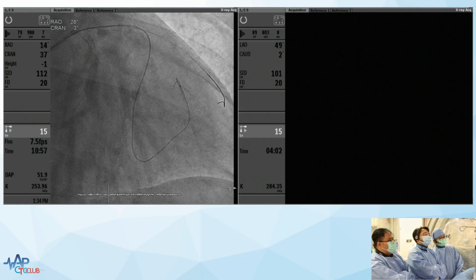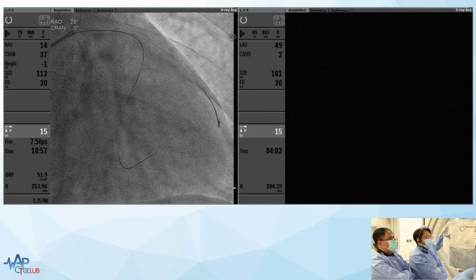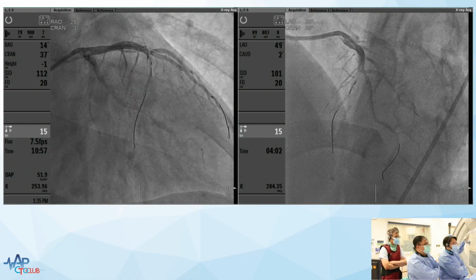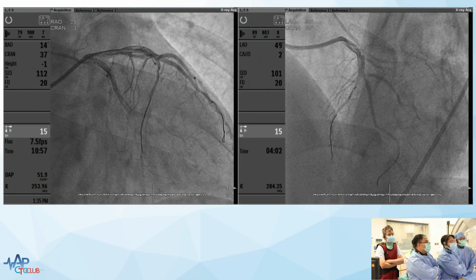Okay. So I guess you've made a lot of progress, and I think this is a really important time to discuss the pros and cons of the approach. Because Sarah, you were saying? Yeah, I'd probably like to try and make a bit more progress antegradely at this point, just because the antegrade cap is still ambiguous for me, and I don't really understand it angiographically, which is now how we're working. We've resolved our distal ambiguity because we've got a microcatheter and good injections, but our target is the septal antegradely. So I'd probably leave the wire there, retrograde, take the microcatheter and put a dual lumen over the septal and then try to make some progress antegradely, even if you just get a bit more purchase in the mid LAD after the septal and diagonal.